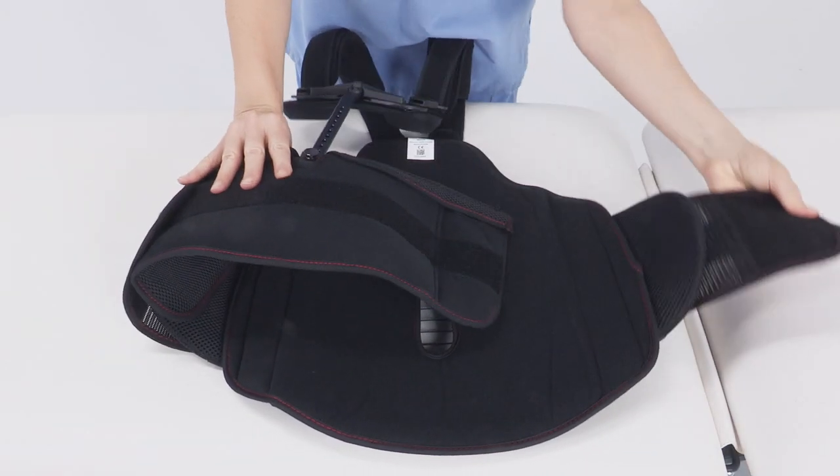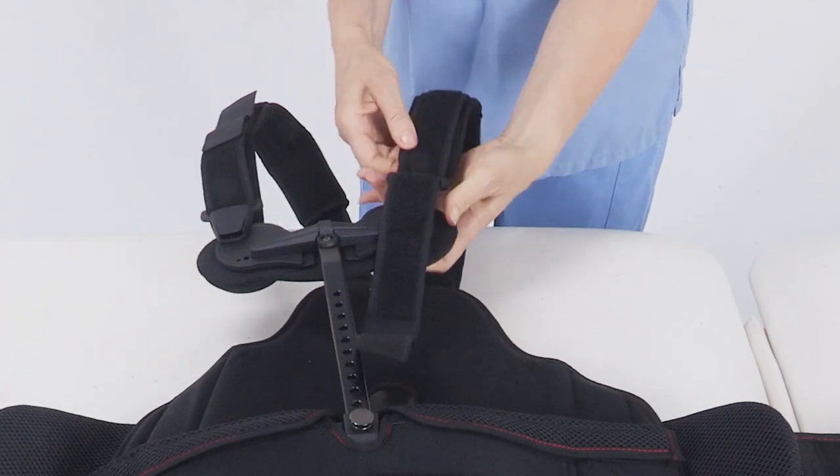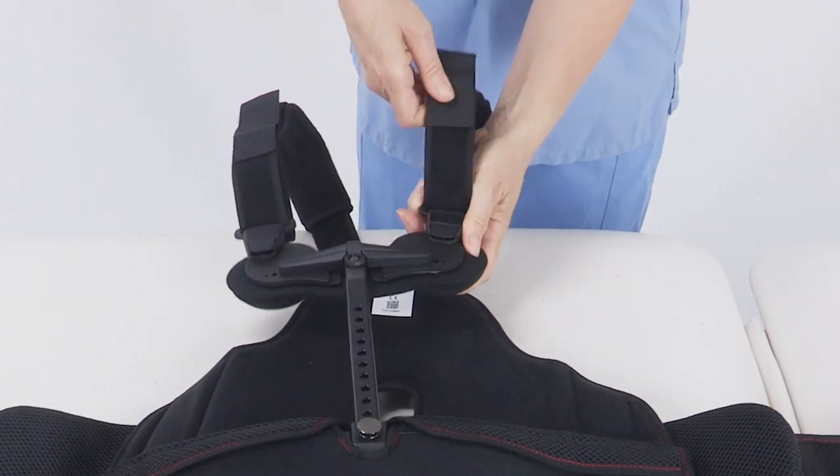Prior to applying, open both of the side Velcro panels. Keep the shoulder straps attached and extend to maximum length.